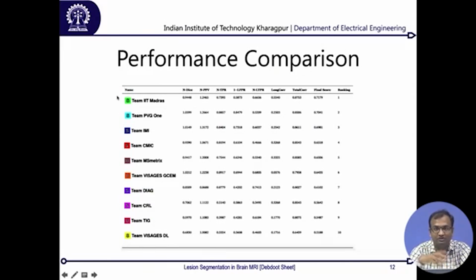using a convolutional neural network in order to do multiple sclerosis segmentation on volume. So it was a 3-dimensional CNN which was being used. So all of the kernels in your CNN which you have implemented till now, which were 2D kernels, now over here become 3D kernels. And with today's state of the art tools, say we had done it with Torch, you can actually implement these kinds of 3D CNNs. So the command over there is volumetric spatial convolution, and you can easily implement a volumetric convolutional neural network on the 3-dimensional space.